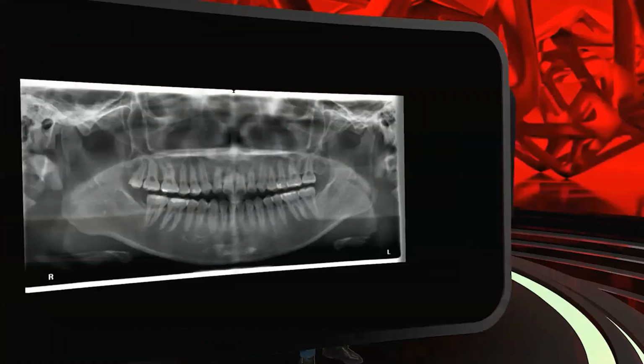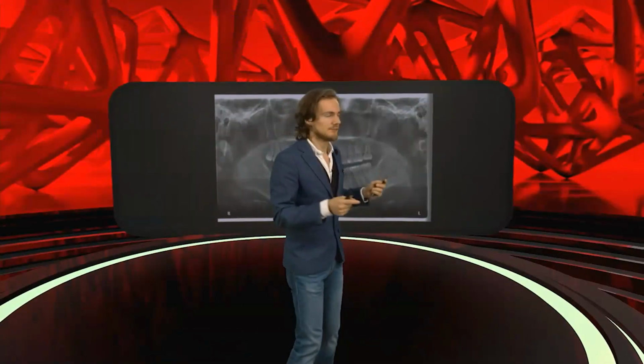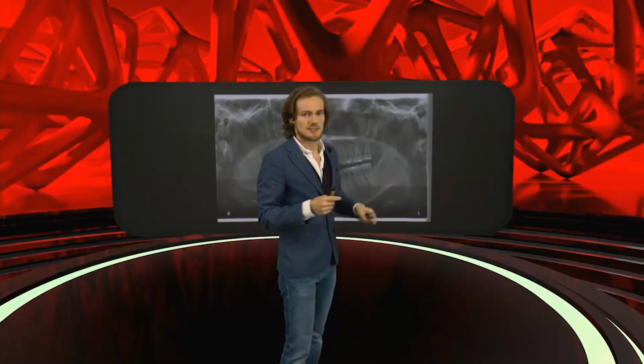So if this patient is symptomatic, I would definitely refer for a CBCT of both condyles. But if the patient is fine, and I do not see anything terribly suspicious, like a tumor or something, I will leave him alone. Let's leave your patient alone if he's fine. We are not looking for problems that do not exist. The same thing in here.